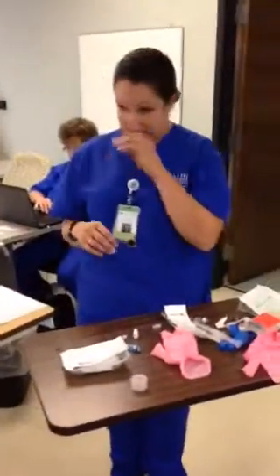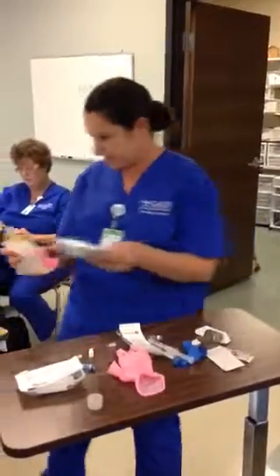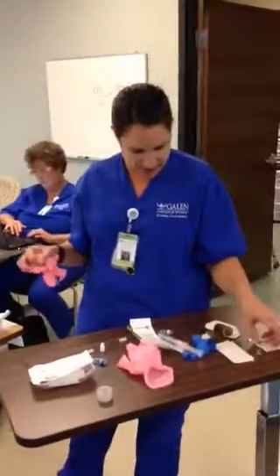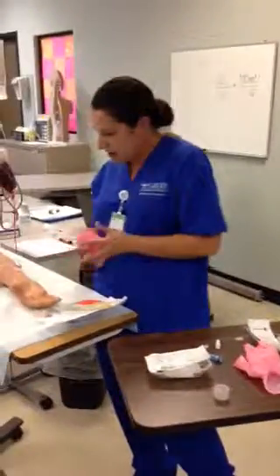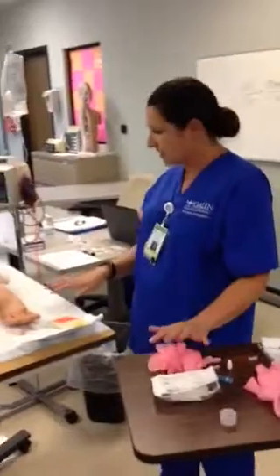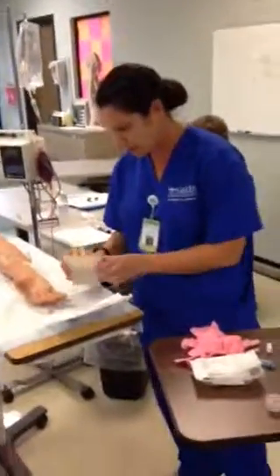So we ready for the next part? Okay, Miss Pearl, I'm gonna start this IV piggyback here. This is your antibiotic that the doctor has ordered. Give me just a second to get my equipment prepared, and then I'll be right back.